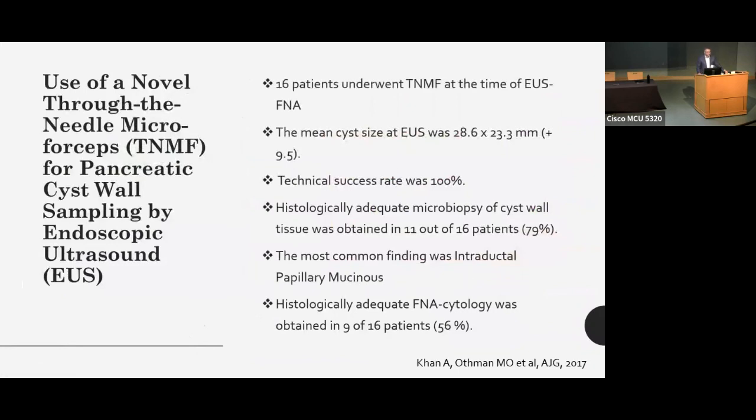But what is the but here? We're seeing more bleeding, and there is a recent study published in Europe with one case of death from severe pancreatitis after using it. There was a nice editorial in Endoscopy by Doug Adler talking about it: it's a great device, but is it worth the risk? I really don't know the answer for that, but I'll tell you, I see the bleeding.